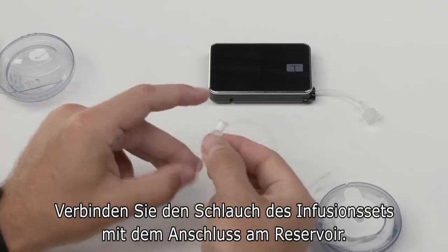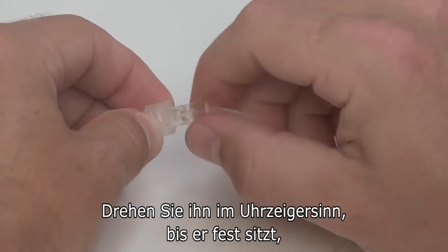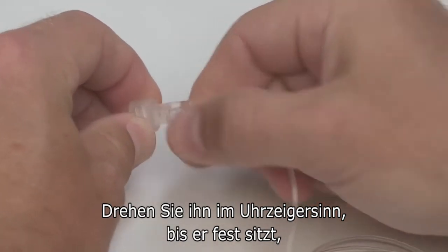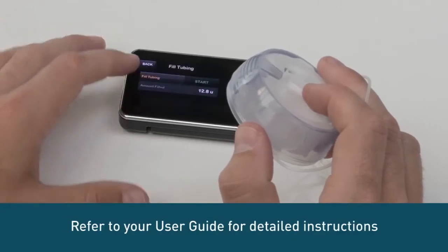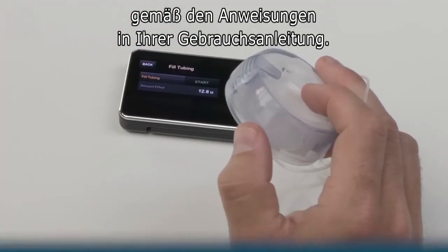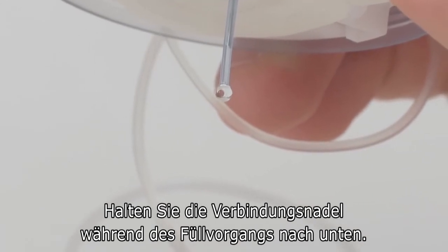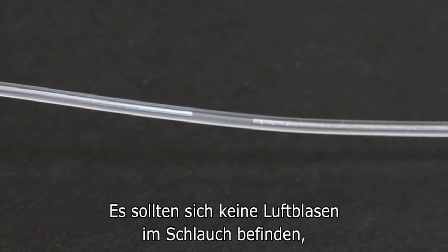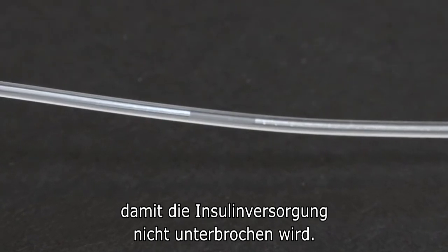Attach the infusion set tubing to the tubing lock connector on the cartridge. Twist clockwise until finger tight, and then twist another quarter of a turn to ensure a secure connection. Fill your tubing according to the instructions in your Tandem pump user guide. When priming the AutoSoft 90 infusion set, hold the connector needle pointing down. Make sure there are no gaps of air in your tubing to reduce the possibility of interrupted insulin delivery.